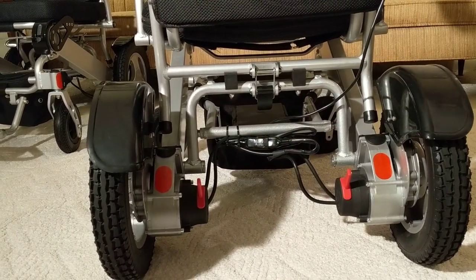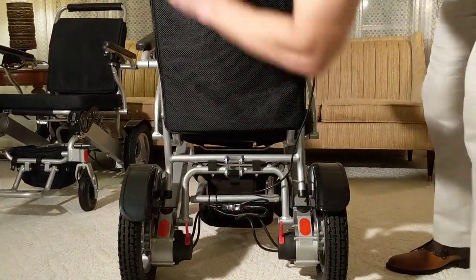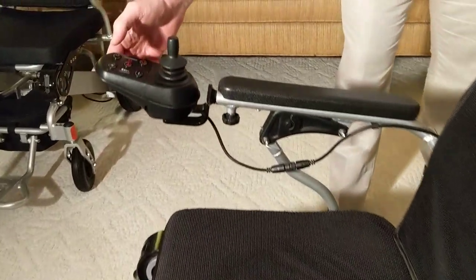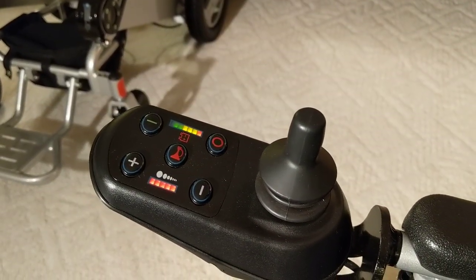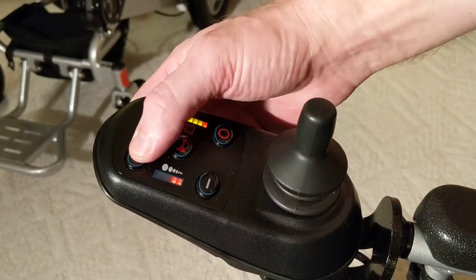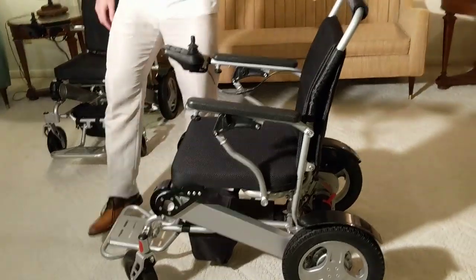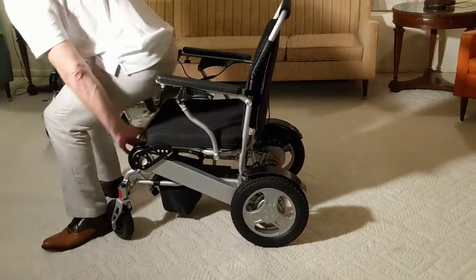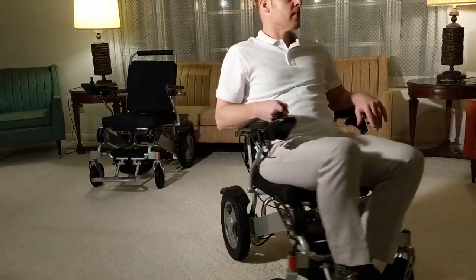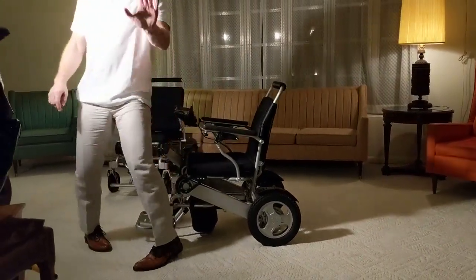The chair works perfectly fine in those areas. Looking from a sideways view, you can see how quick and easy it is to go from electric to manual and back. The joystick controller is very similar — you can see the battery life, it has a horn, and you can adjust the speed very quickly and easily. I'm going to show you the turning radius — it's very easy to get in the chair, and with one finger I can very easily maneuver the chair and do 360s.